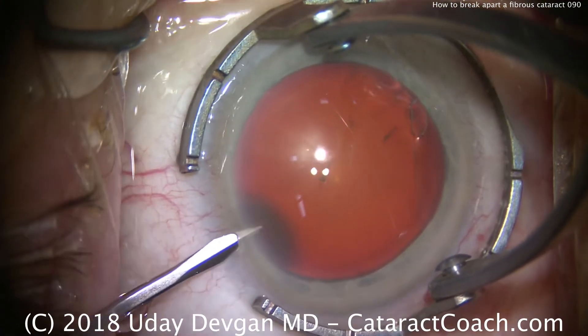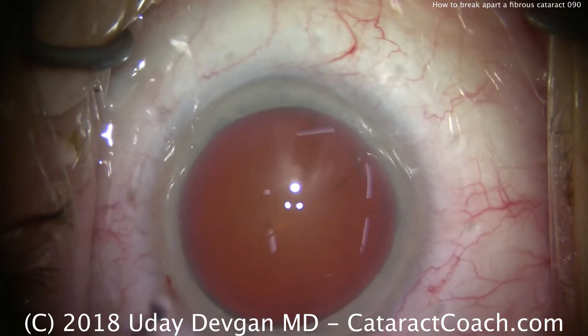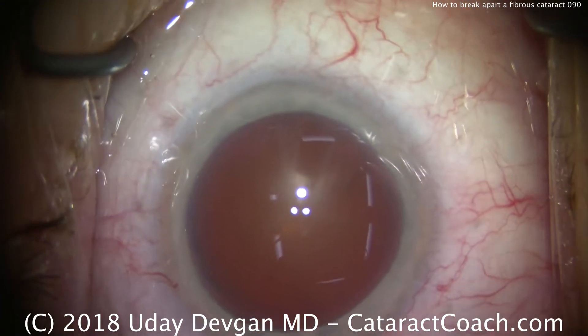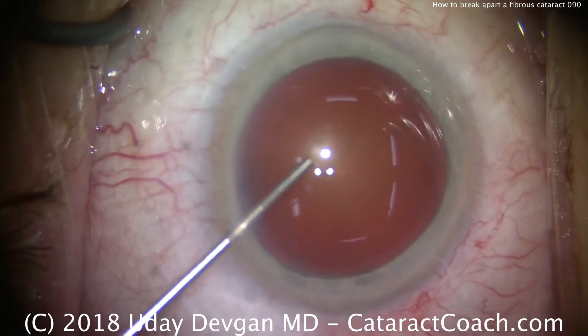CataractCoach.com and we're looking at a case of a cataract that we know ahead of time is going to be fibrous and tough to break apart. So we're putting some anesthetic in the eye, squirting the surface of the eye as well, and now filling the eye with our dispersive viscoelastic.